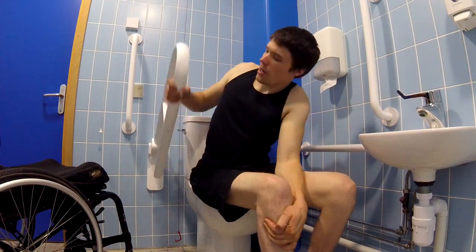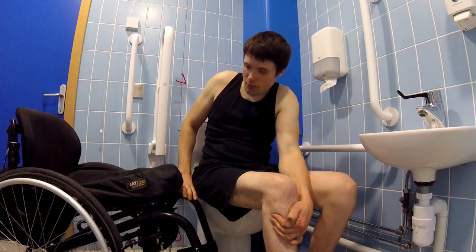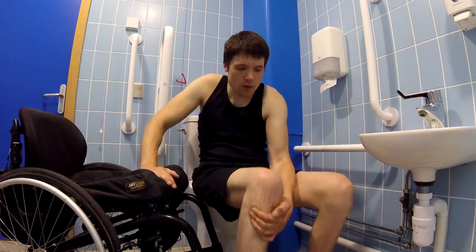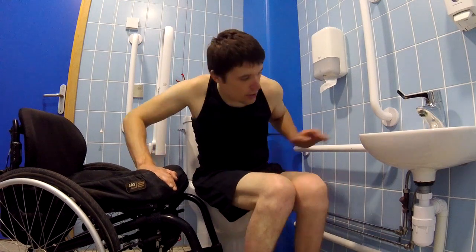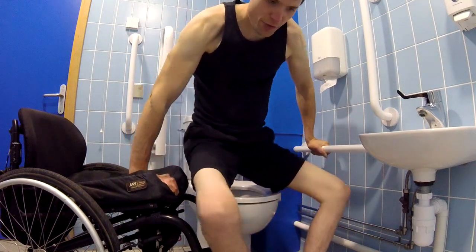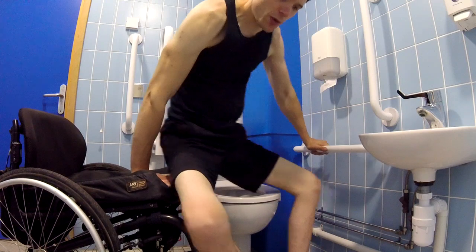Now to get off the toilet, I will lift this out of the way, bring my chair near me, lock it, and grab the bar like so. Lift and twist.